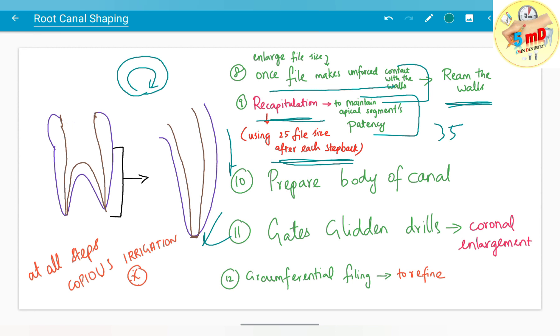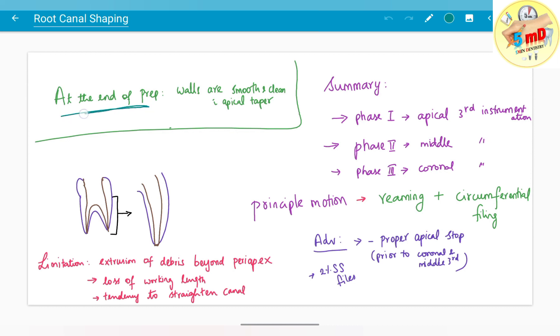The body of the canal is prepared and Gates Glidden drills are used for coronal segment enlargement. Circumferential filing is preferred to refine the walls. This smoothens and cleans the walls for a proper taper. At the end, the walls are smooth and clean with a proper taper.